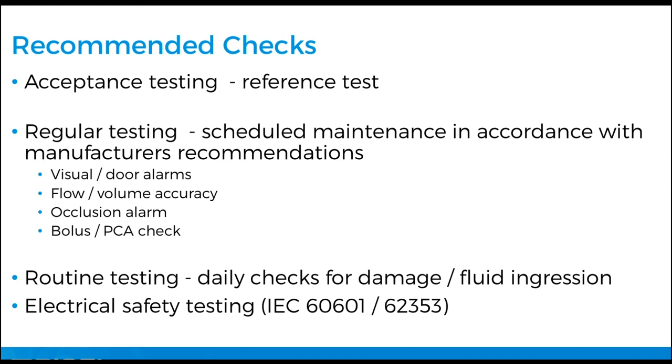And then you might want to do a bolus or patient controlled analgesia check, which the multi-flow has that capability. And then routine testing, daily checks for damage, water ingression. So it all depends on how your risk management is set up within your healthcare organization. I also mentioned earlier about the non-scheduled maintenance, which could be down to damage and some kind of repair. It's been knocked over, give it a quick check.